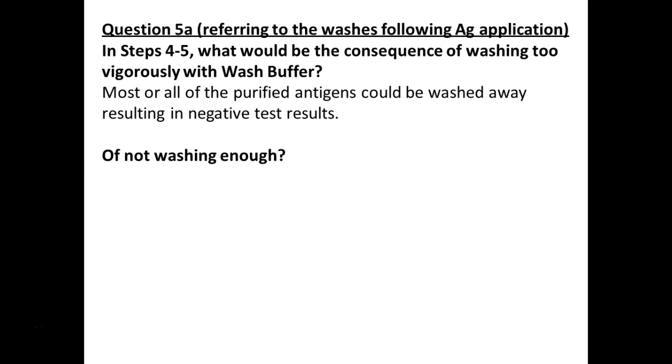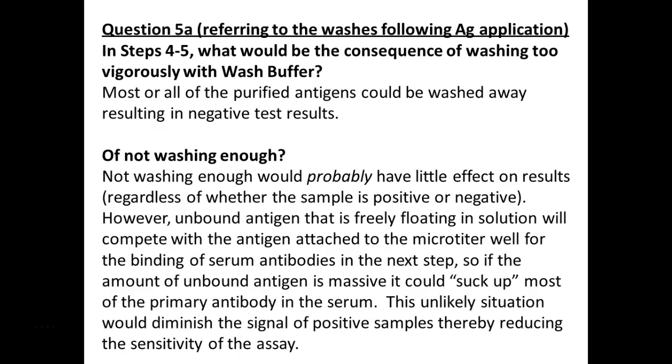What if we don't wash enough, though? You're not really going to get false positives, right? But you're going to get competition here, where stuff that isn't bound is going to soak up the stuff we put in and prevent it from sticking. Right? It'll soak it up. And this will affect the sensitivity of our test.